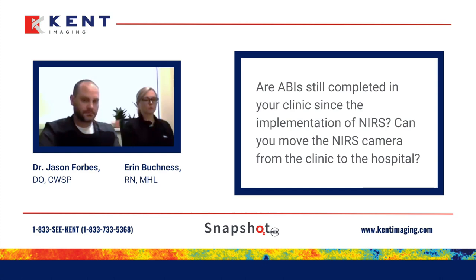And there's actually a question that came in. Do you continue to complete ABIs in the clinic since starting this technology in the office? But you just made the point that the technology is portable and you bring it to the clinic and the hospital, yes? Yep. The camera's small, probably about that big, couple pounds.